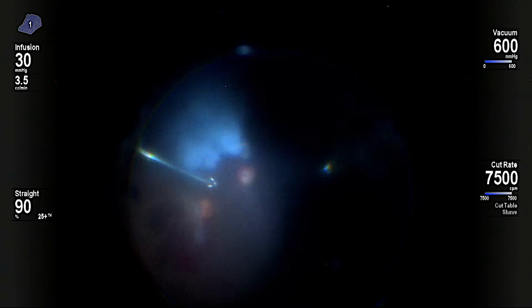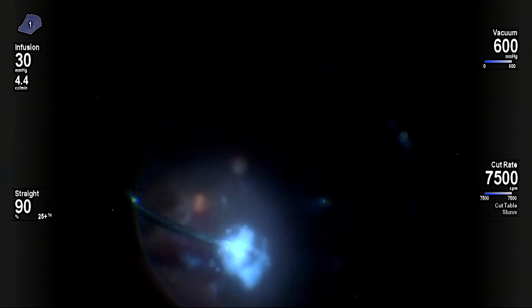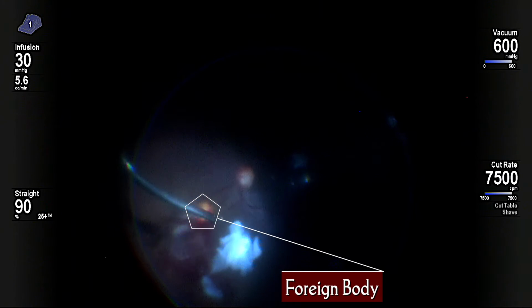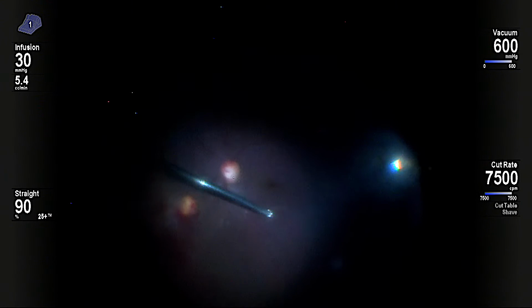This is a 15-year-old boy referred to me as a case of dropped cortical matter, who was earlier being operated for post-traumatic cataract. On examination, a small yellowish elevation was seen in the inferonasal quadrant, so a foreign body was suspected.